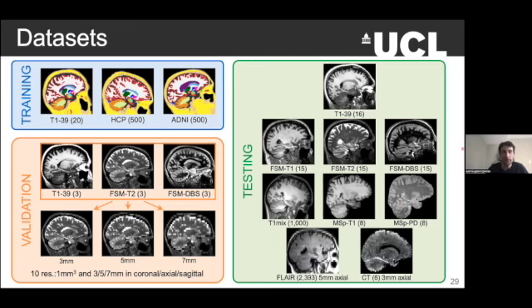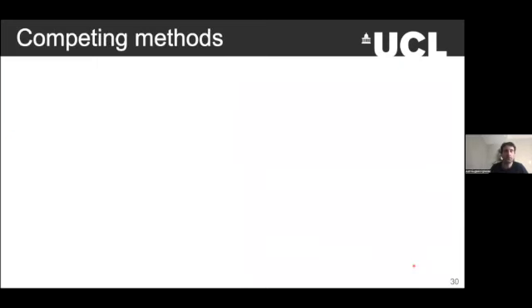And we also took a couple of thousand FLAIR scans from ADNI. So they're 5 millimeter axial. These are pretty interesting because in ADNI you also have the 1 millimeter MPRAGEs. So what you can do is process the 1 millimeter scans with FreeSurfer and then use them as ground truth. It would be a silver standard for these. And we also found this small data set of CTs, these are 3 millimeter axial CTs that had corresponding MRIs. So we can play the same game and use the segmentation of the MRI as ground truth.